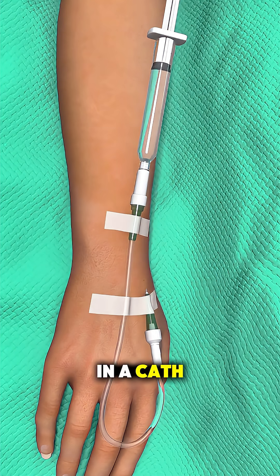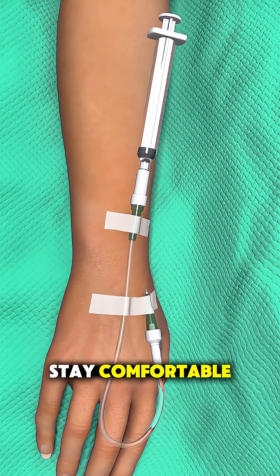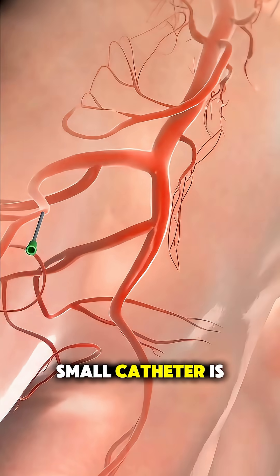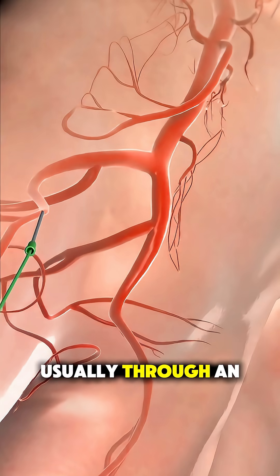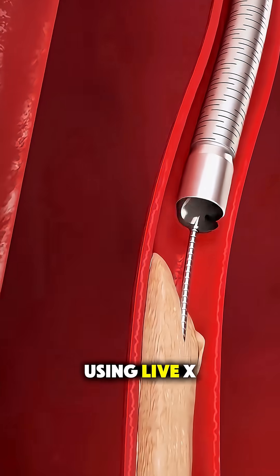It all starts in a cath lab, where the patient is given local anesthesia so they stay comfortable but awake. A small catheter is inserted, usually through an artery in the leg or wrist, and guided toward the blocked area using live X-ray imaging.